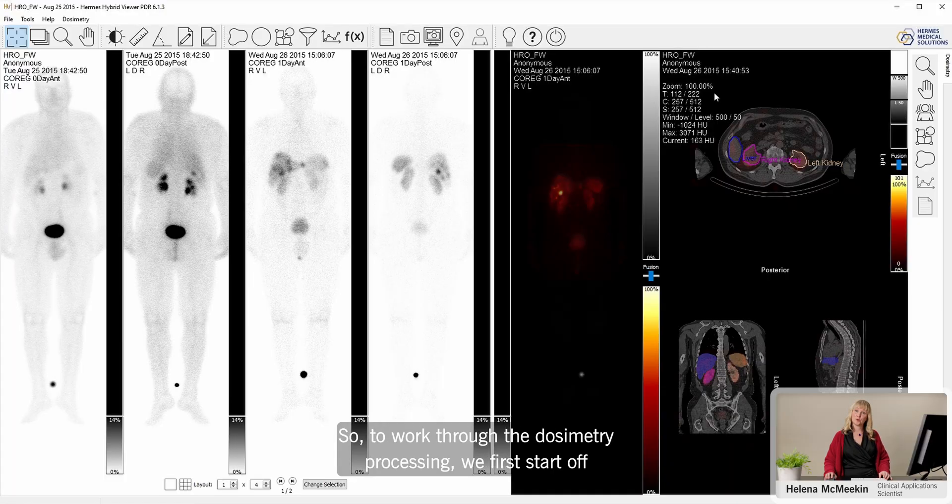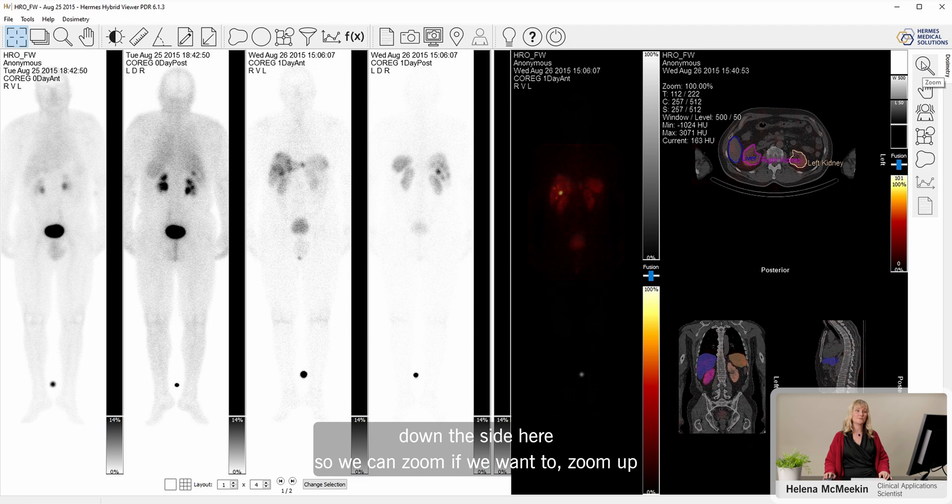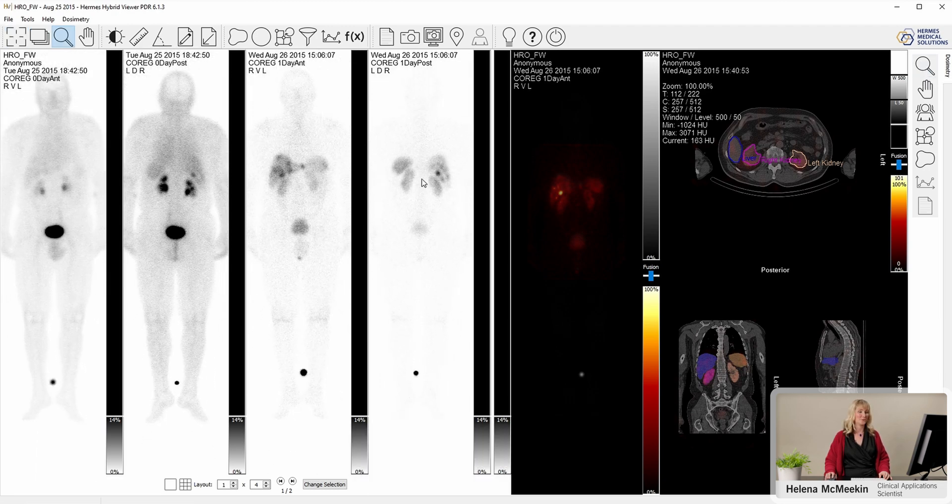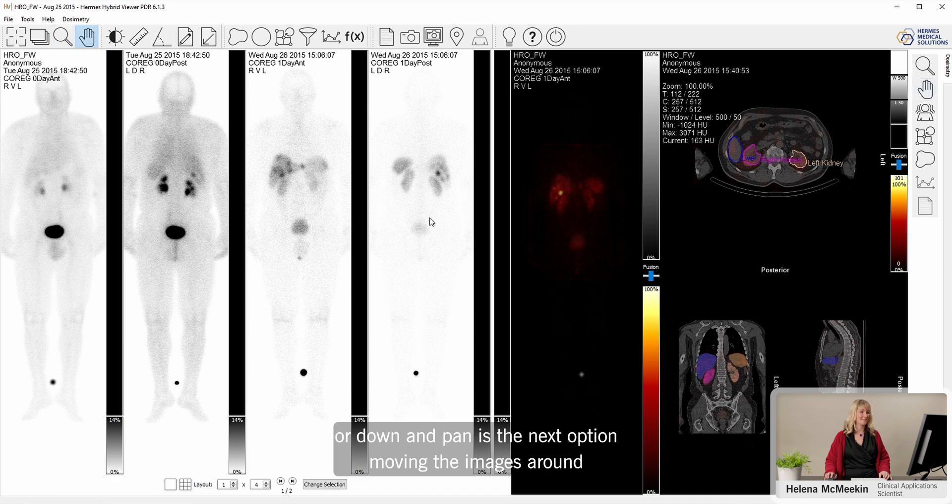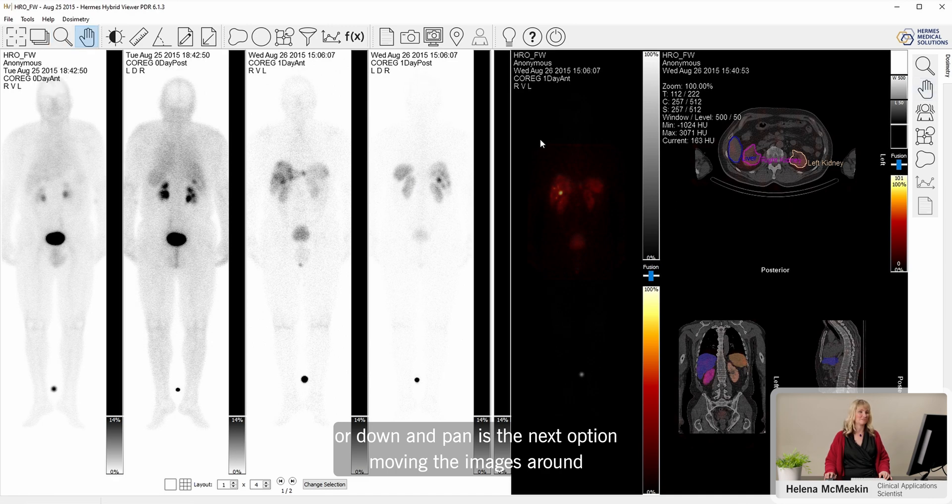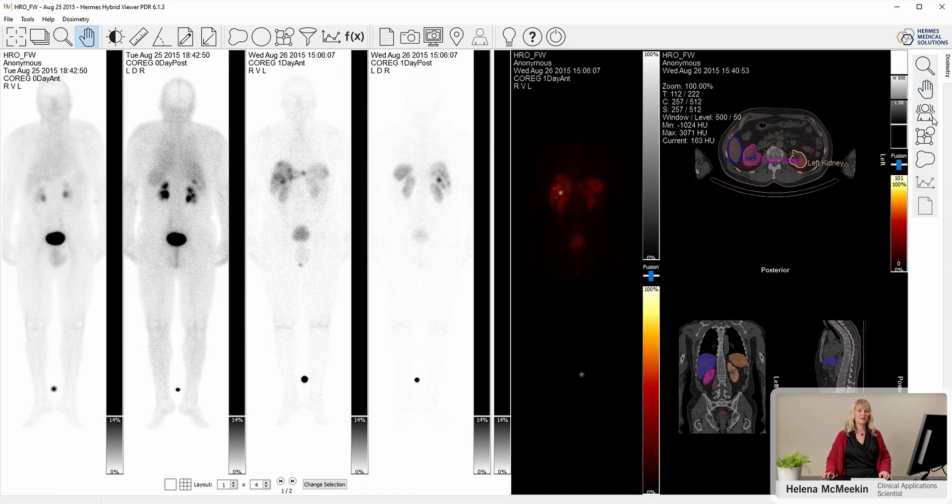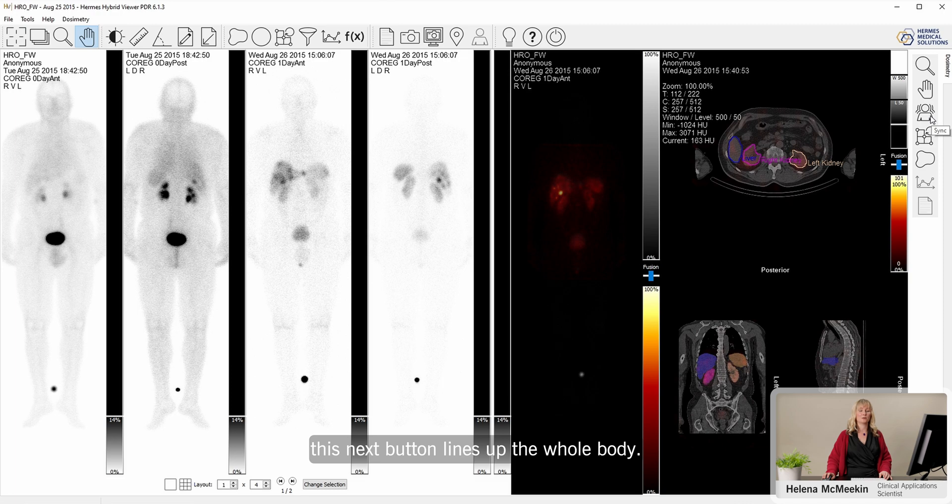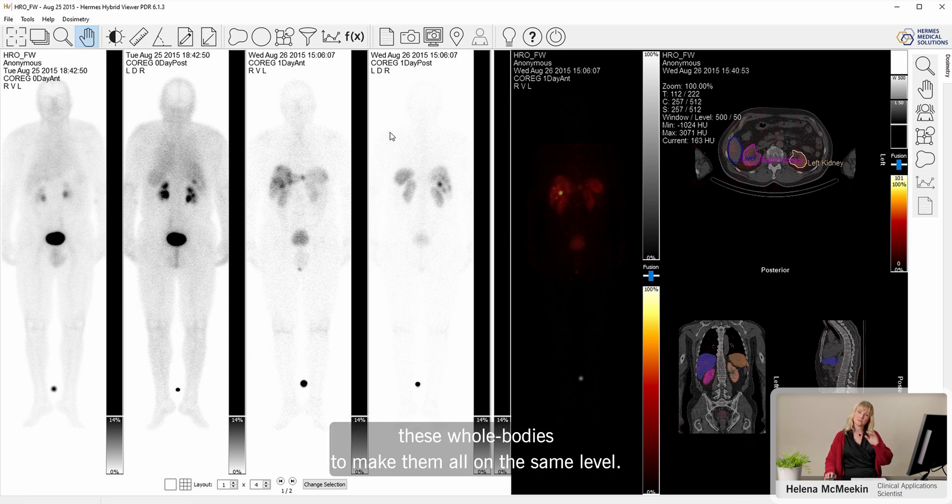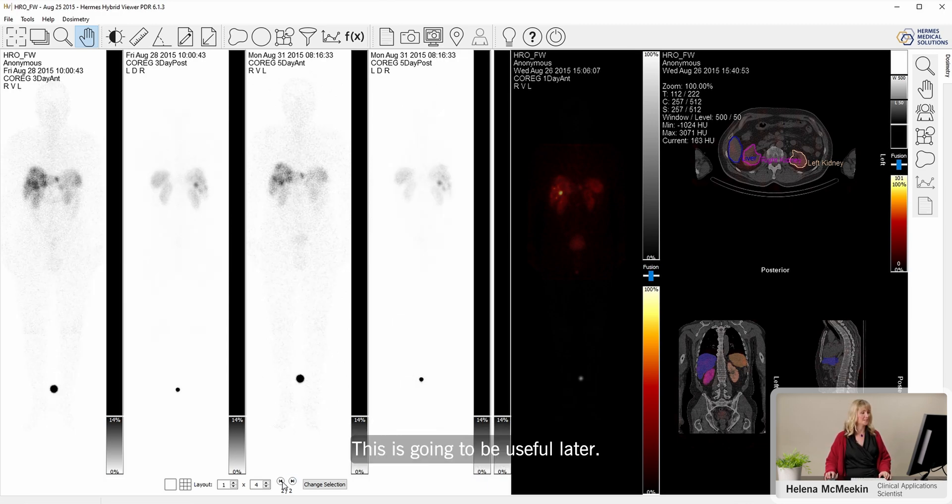To work through the dosimetry processing, we first start off down the side here. We can zoom if we want to, zoom up or down. Pan is the next option, moving the images around. This next button lines up the whole bodies. So I'm going to click this one, and then the application will automatically try to realign these whole bodies to make them all on the same level. This is going to be useful later.